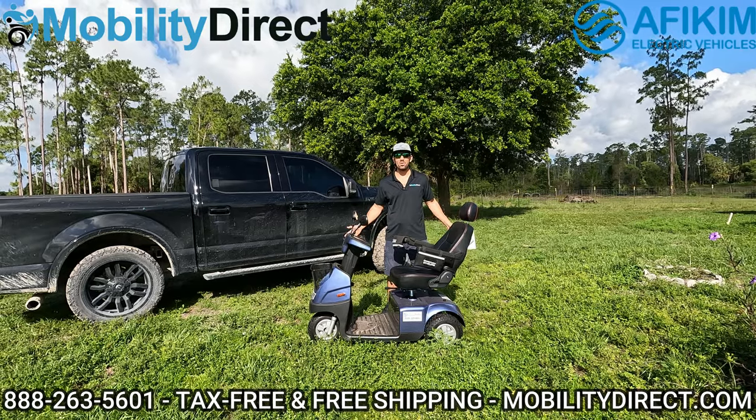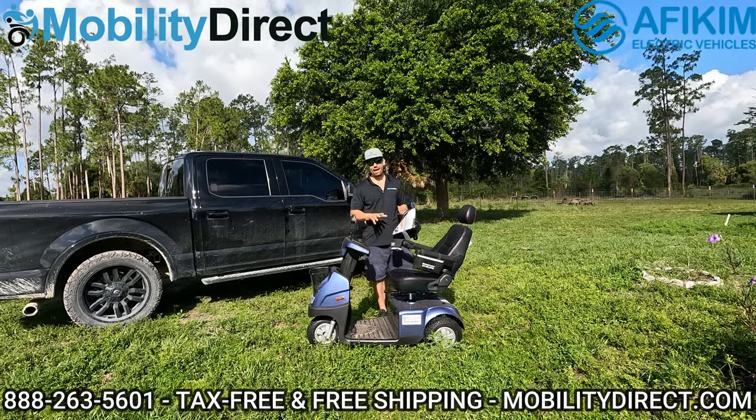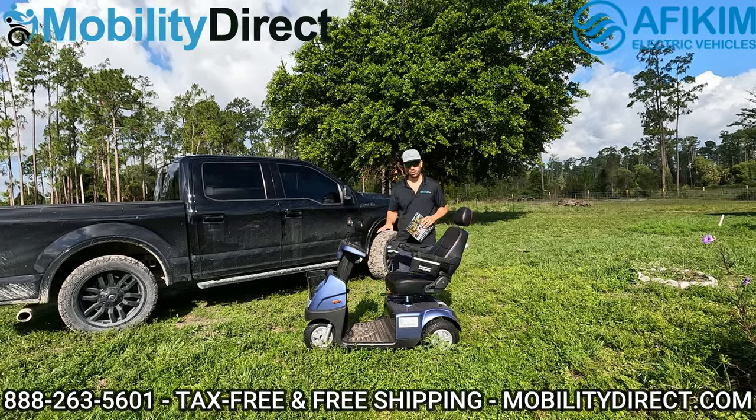Hi everybody. I'm Sergio with Mobility Direct, and welcome to today's review video of the Afikim Afa Scooter C3.